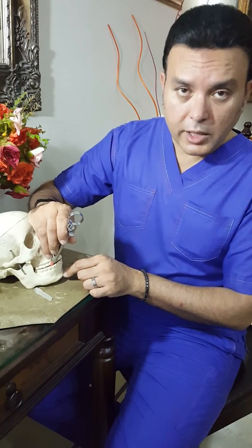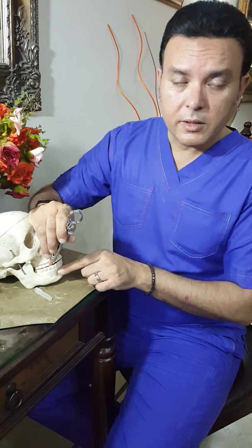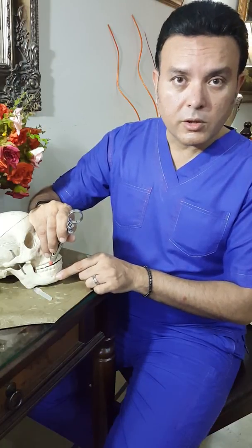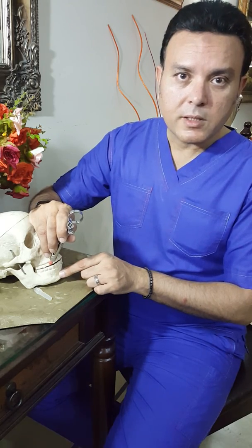Please take this into consideration: if you are trying to work on any of the primary pediatric teeth — including the molars, canines, and incisors — all you need to do on the lower arch is give a mental nerve block, and that would suffice. Thank you.